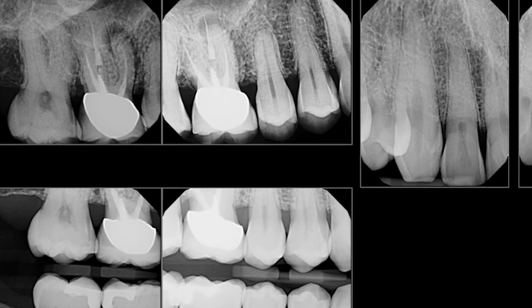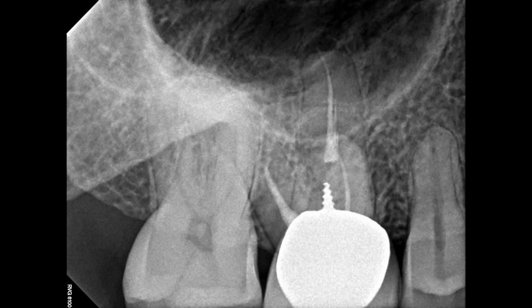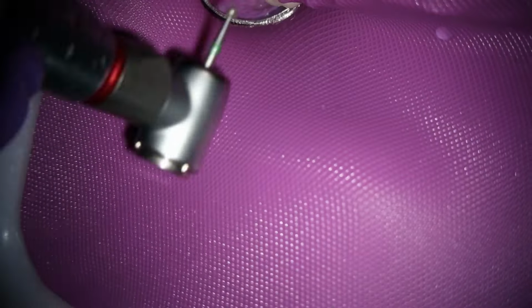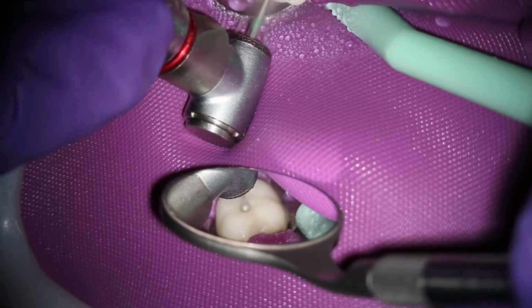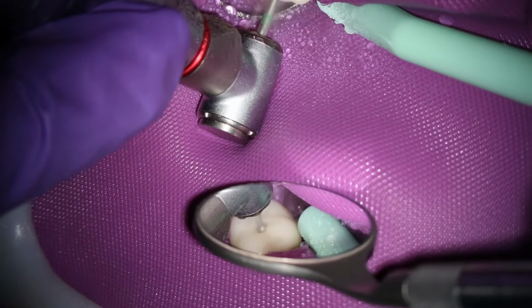The last example is a retreatment case where I have to go in, I have to take a post out, I have to find an MB2. So here again, I move the mirror away from where I'm actually drilling. And you can see it's not getting dirtied by the water spray. I can still make a very accurate access. Again, the mirror is down towards the bottom of the dam frame.